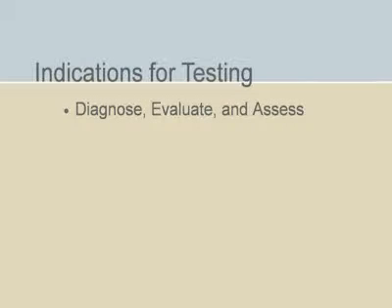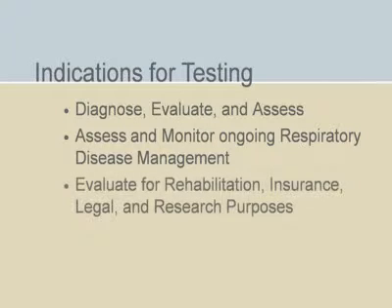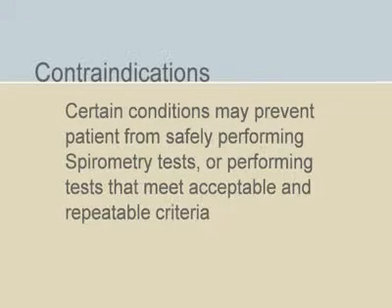Next, verify the clinical indication for testing and any possible contraindications. Key indications for spirometry testing are: diagnose, evaluate, and assess. Assess and monitor ongoing respiratory disease management. Evaluate for rehabilitation, insurance, legal, and research purposes. Most patients, pediatric and adult alike, can safely perform spirometry tests.